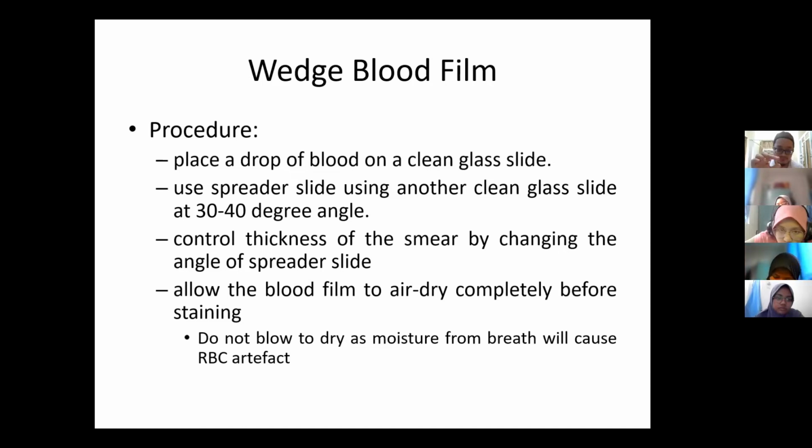No, tak ada, kita bagi estimate saja. You have a subjective estimation. So you control the thickness of the smear by changing this angle. Situ kemudian you pull back and then you push so that it becomes a smear.